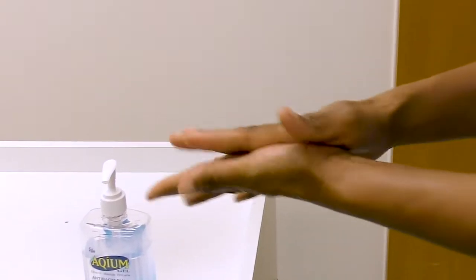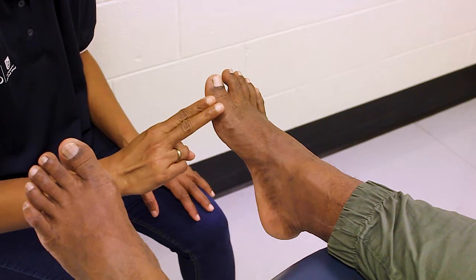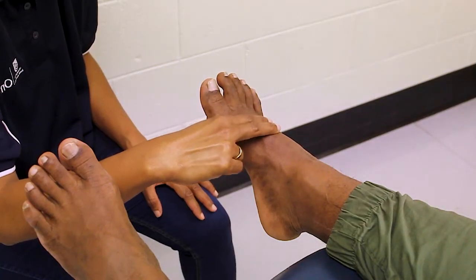Start the process by ensuring correct hand hygiene practices have been followed before seeing a new client. Using your pointing and middle finger, locate the pulse you are looking to find with the Doppler. Watch our video on how to find the pulse on a foot if you are unsure how to do this.